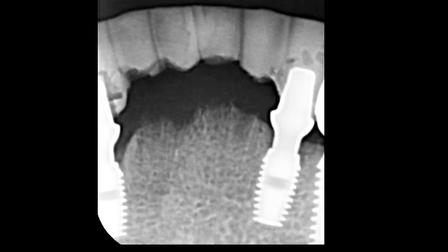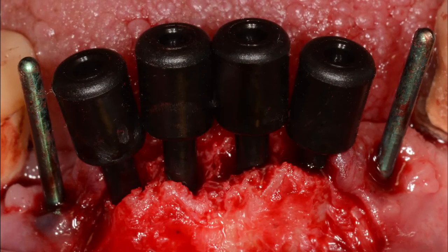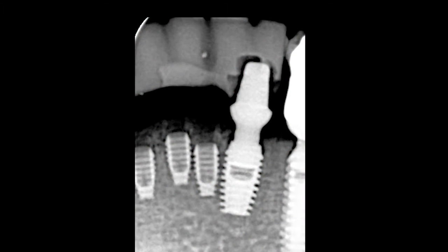Prior to preparing the osteotomies, the two nine-year-old canine IACs were removed and set aside. Green guide pins were inserted into the well of the canine implants to act as a trajectory guide for the preparation of the incisor osteotomies. The implants were placed with the two-stage protocol and a transitional fixed prosthesis was fabricated utilizing the nine-year-old canine implants for support.